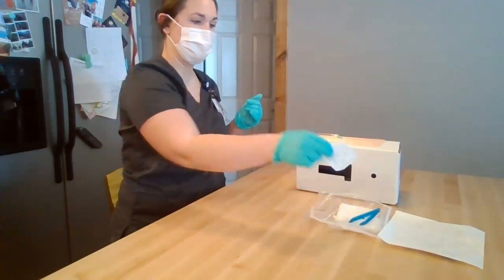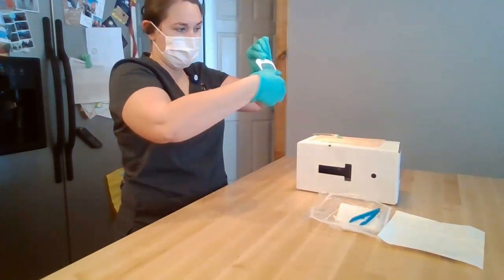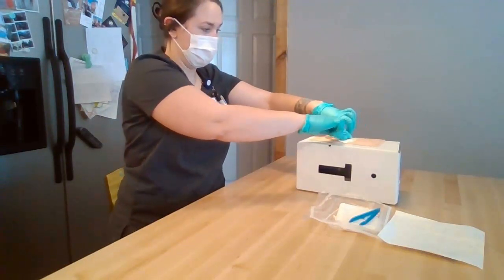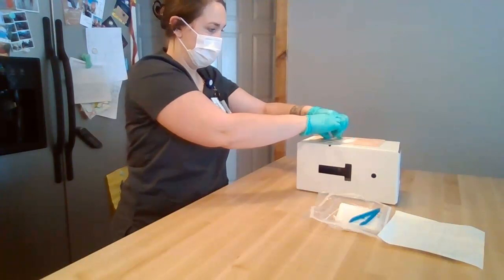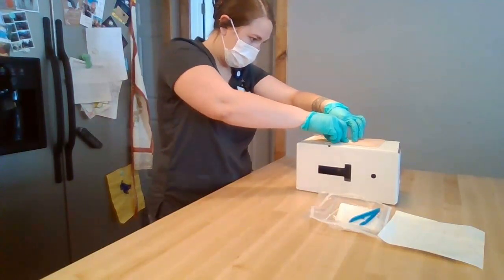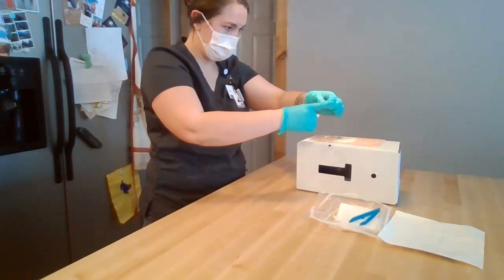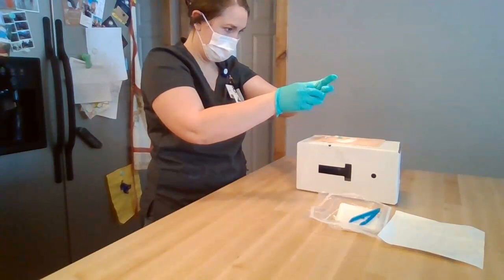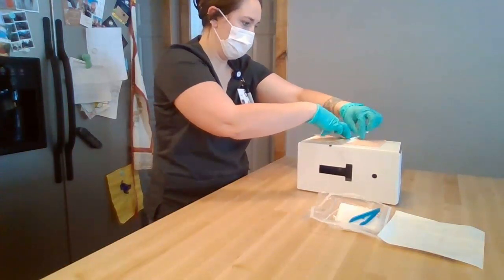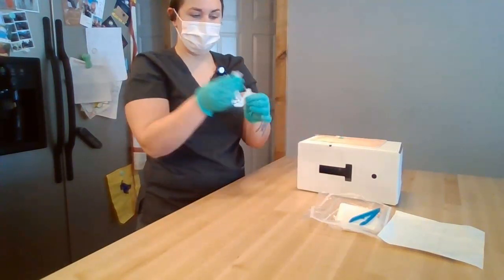I'm going to get my sterile dressing out of my sterile kit, remove the back piece, and throw it in the trash. Then I'm going to place it over the catheter and make sure to press all four sides of the dressing down. Then I'll remove the white piece, pressing down all four sides, confirming all four sides of the dressing are secured. I'm going to discard the packaging in the trash.